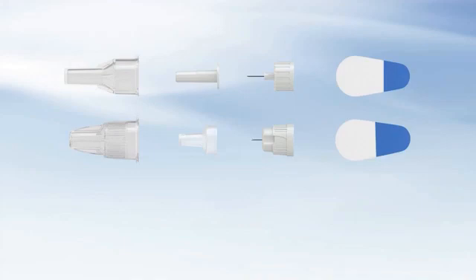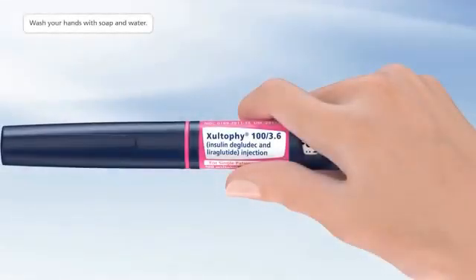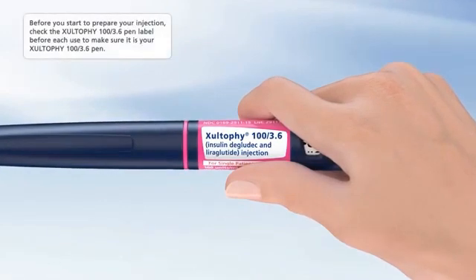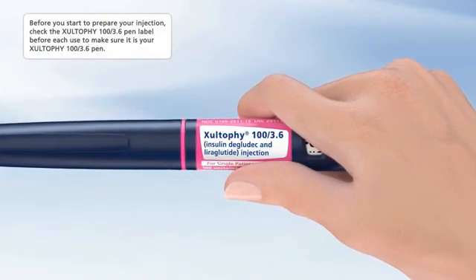Now you are ready to go through the steps for how to inject Zultify 100 3.6 with your pen. Wash your hands with soap and water before you start to prepare your injection. Check the Zultify 100 3.6 pen label before each use to make sure it is your Zultify 100 3.6 pen.